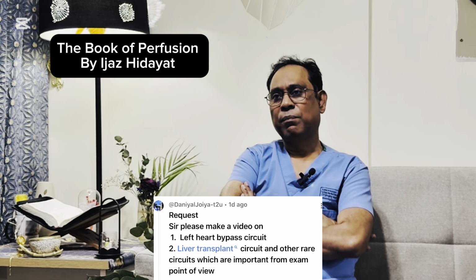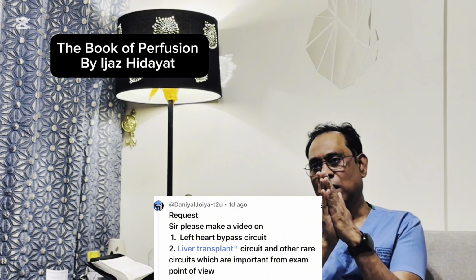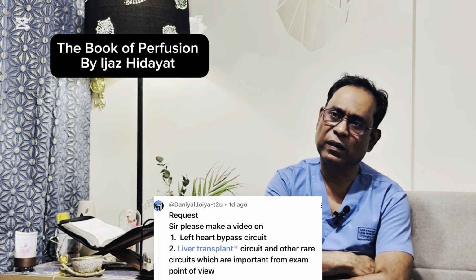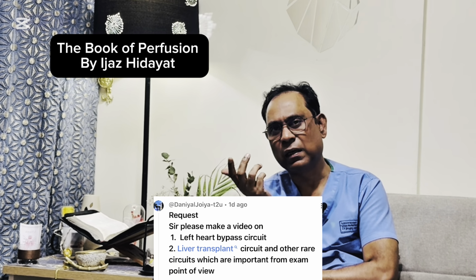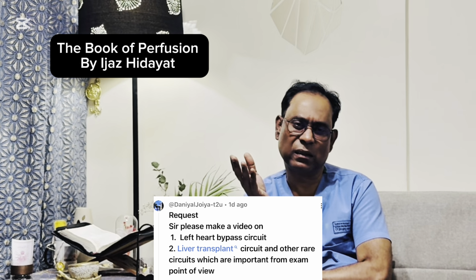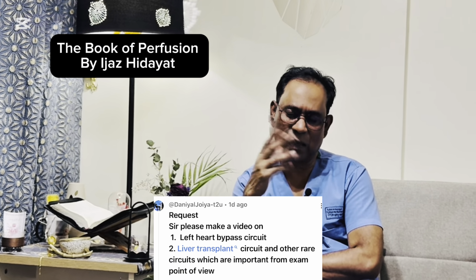For components, you need cannulas and a circuit, meaning tubings. We need two cannulas, one cannula inserted on the access side and the other cannula on the return side. Usually we get blood from the left atrium and deliver it into the descending aorta, and sometimes we cannulate the pulmonary vein. In adult surgery the access cannula should be around 22 or 24 French, either angled or straight cannula.